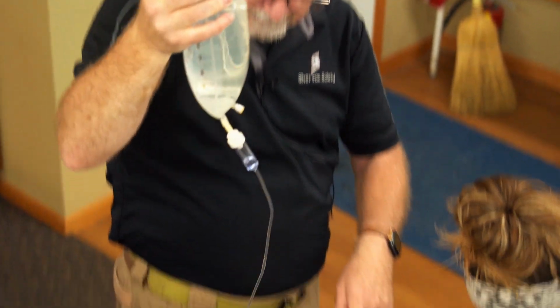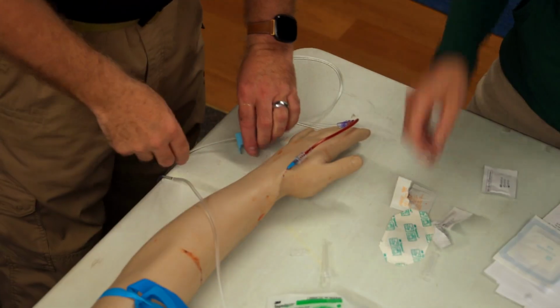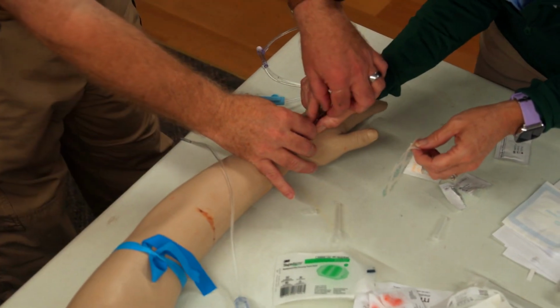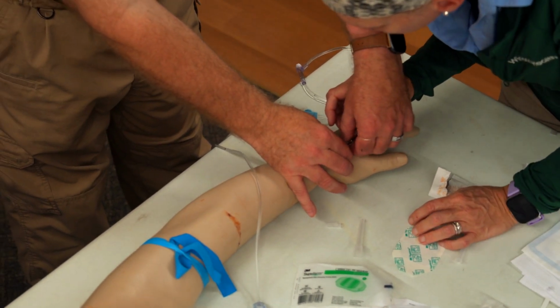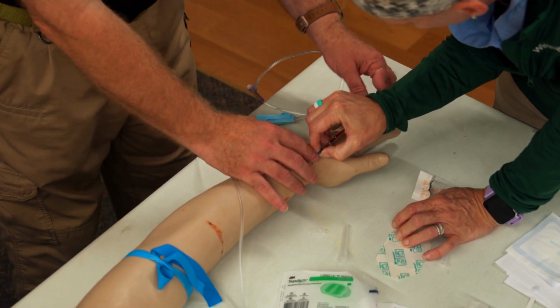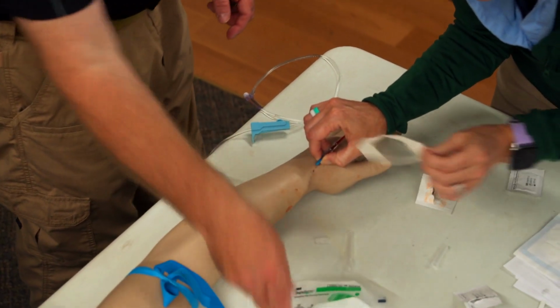Because now, when you're done, oh, yep, it's working. I put some pressure in and it's pushing back, but don't let go of this. Here, look at your hub. Oh yeah, you're fine, my fault, you're good. Don't let go. Just don't let go of that while you're getting this ready. So that's why you have it prepped. Yeah. Okay, go ahead.